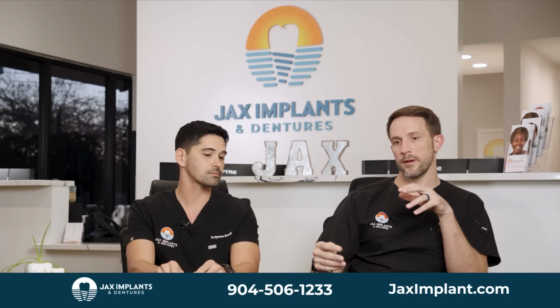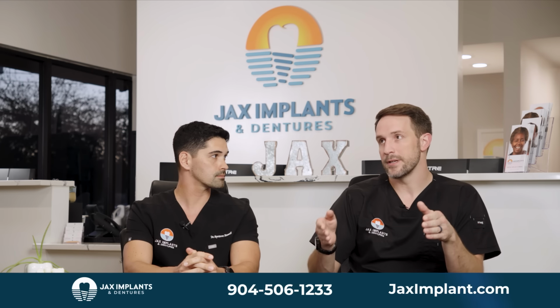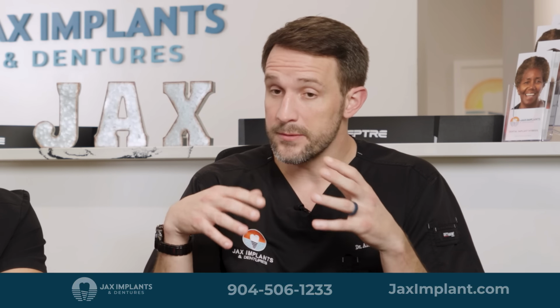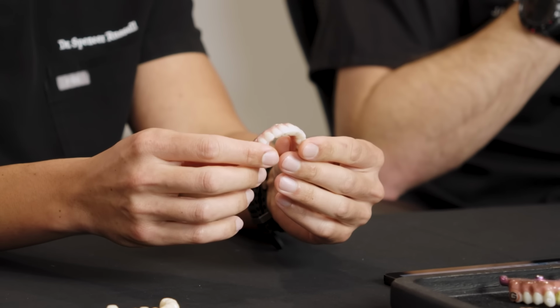Yeah, so all on 4, basically it's a bridge, right? So you don't need to replace every single tooth with one single implant, which is a common question that we get. I would say another big thing that I know seems basic for us because we're dentists and this is what we do, does this come in and out? No, so this is going to stay screwed in. It can come out if your dentist unscrewed it and took it out, but for you at home, it's going to stay screwed into place. You're going to treat it just like your natural teeth. You're going to brush it, you're going to water pick underneath it. You're not going to take it out at night.